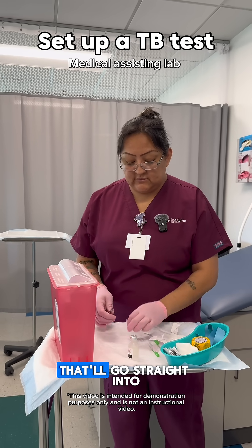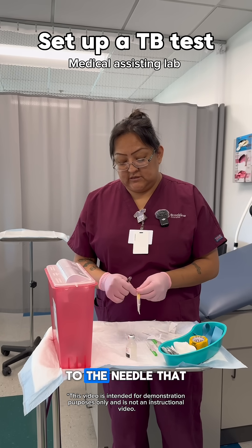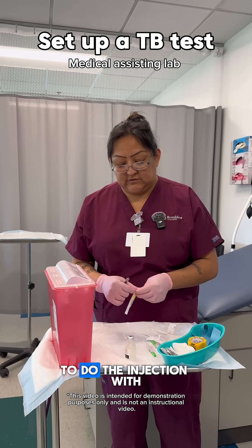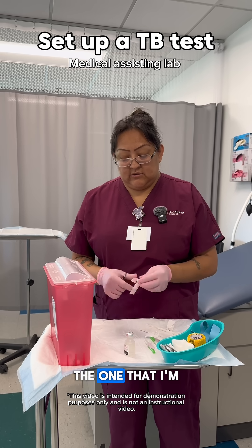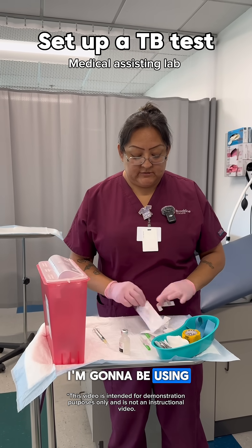Once you're done with that, that'll go straight into the sharps container. You'll switch out your needle to the needle that you're actually going to be using to do the injection with. The one that I'm putting on is a 30 gauge needle.